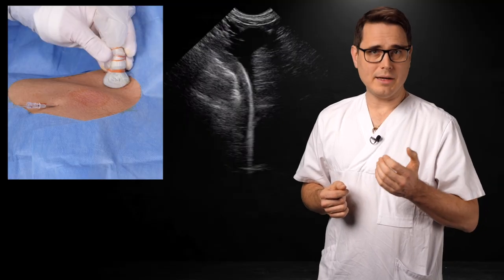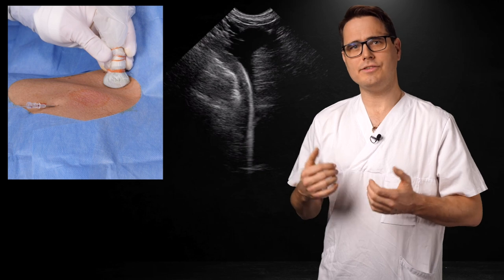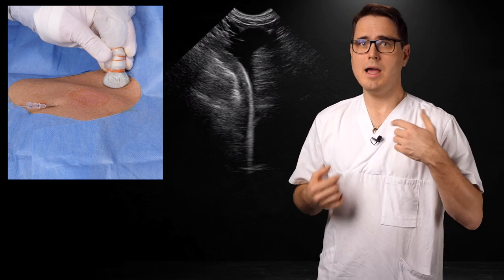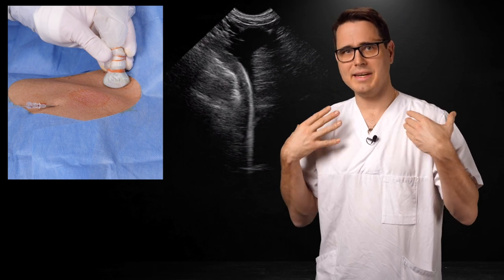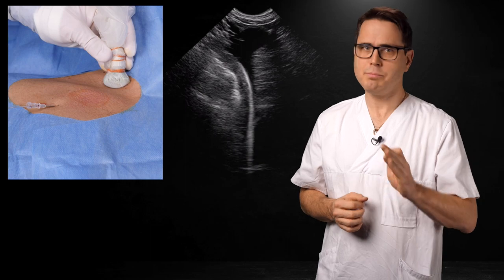This view is obtainable for both IJ and subclavian line placement, as long as you use the right side. You can use it for a left-sided line, but then you have to sterilize both sides of the neck and place the drapes accordingly. It's a bit cumbersome, but it's perfectly doable.